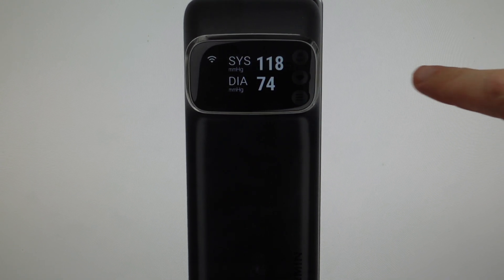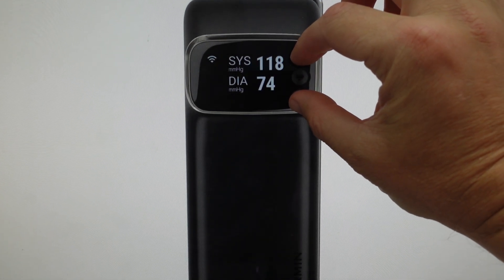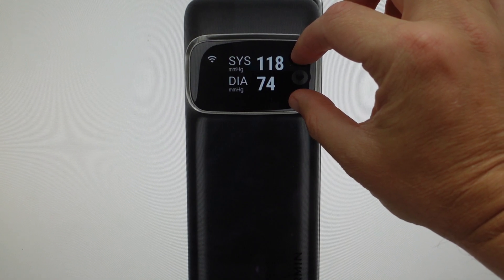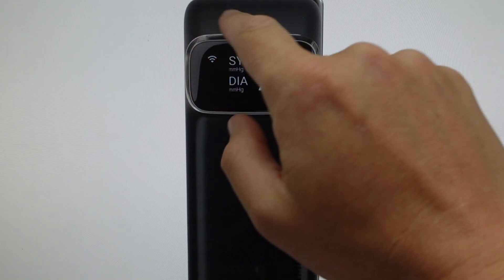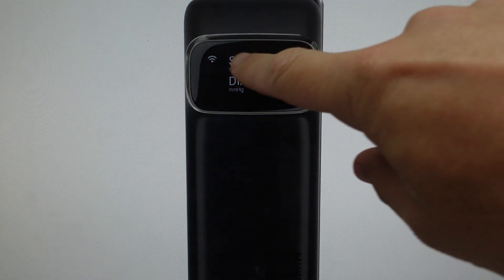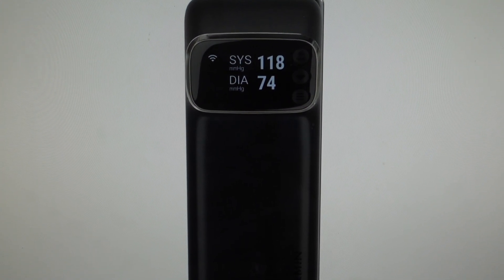All we're going to do is with it on, we're going to find the little user button here and the menu button here, and if we press and hold these two buttons for 10 seconds, we will get on the screen a little gear shifter — like a settings gear — up here on the screen. Then we can let go of the two buttons, it will reset, then it will reboot and we can go ahead and set it up like a new device.